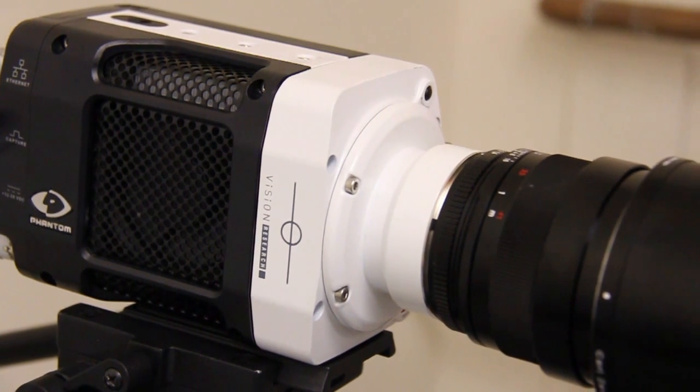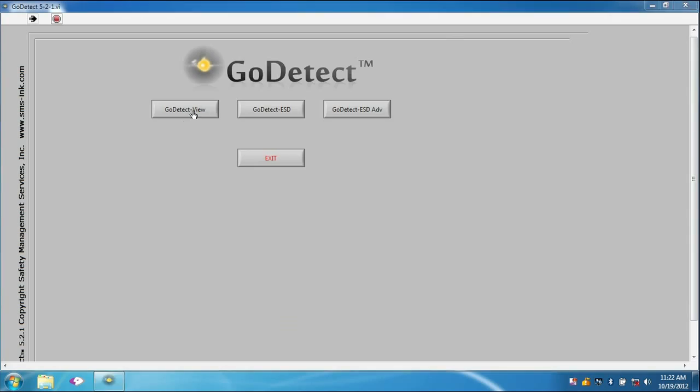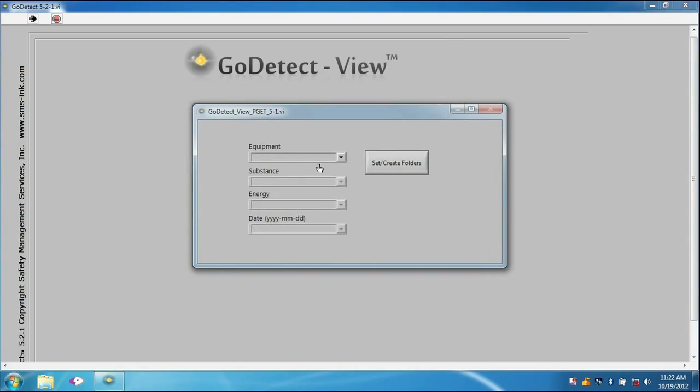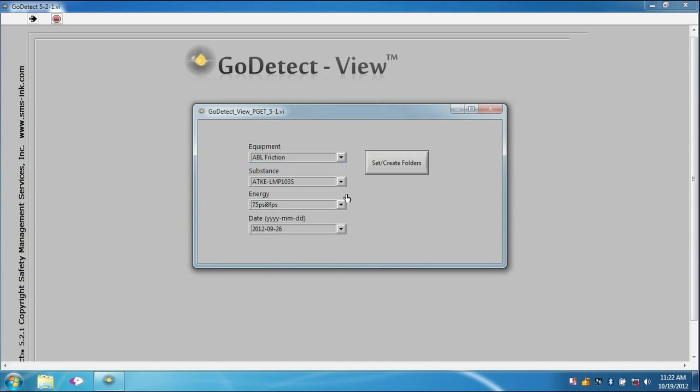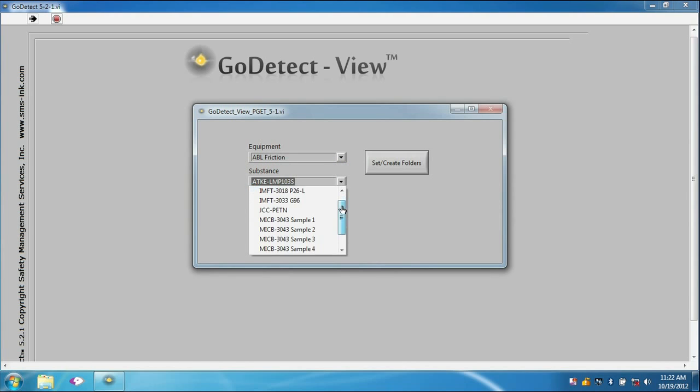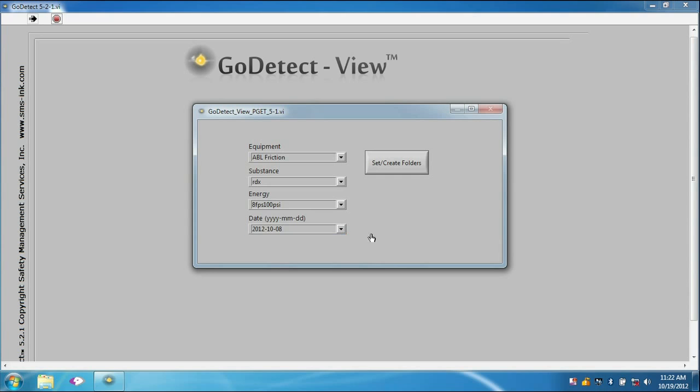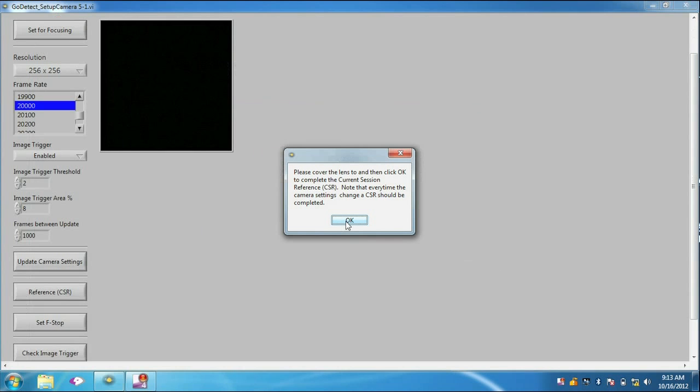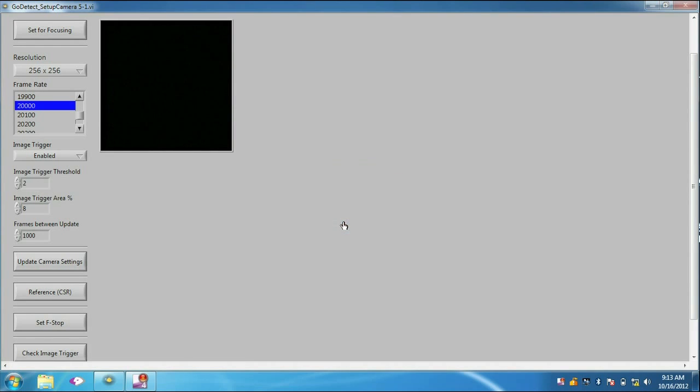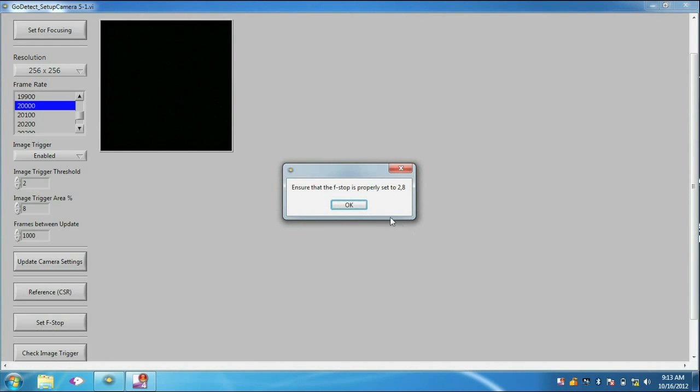With a few simple clicks, the GoDetectView software will automatically create an archived folder for the test trials to be performed based on the type of material, energy level, and the test date. A step-by-step process ensures that the GoDetectView system is set up properly.